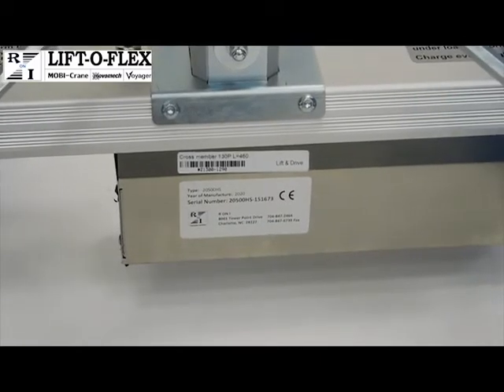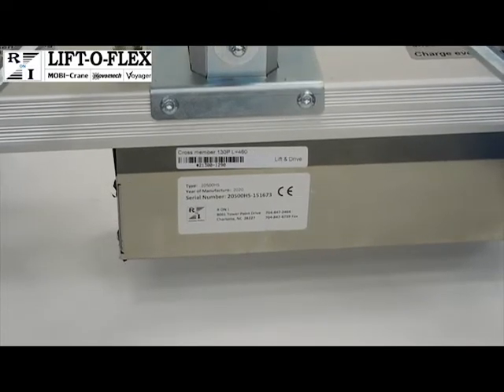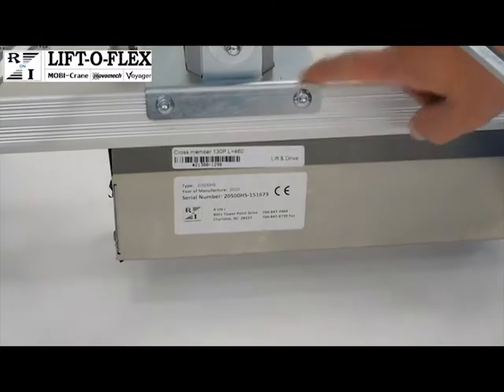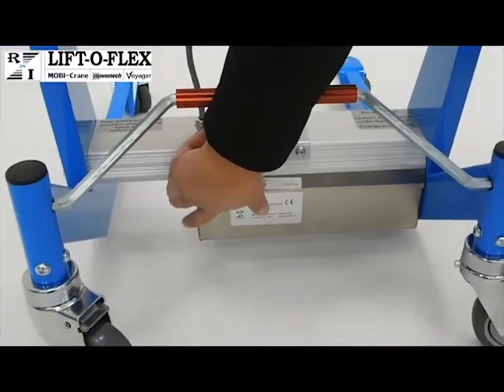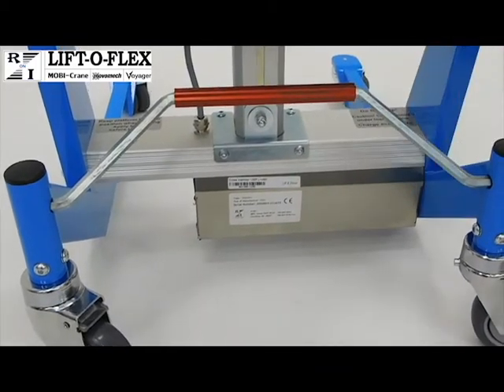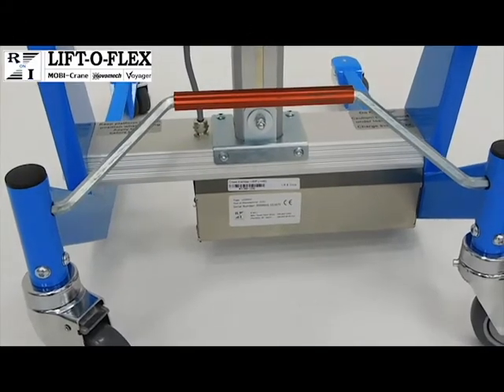There are other serial numbers that you can provide if that sticker for some reason has been lost. This sticker for the intermediate section is normally underneath the intermediate, but is located on the new lifters here. So on older lifters, you'll find it up underneath the intermediate.